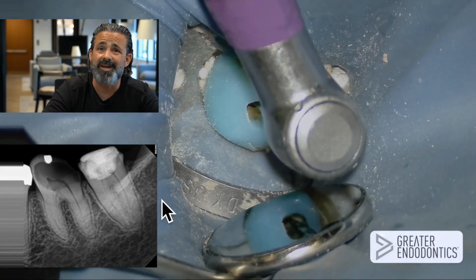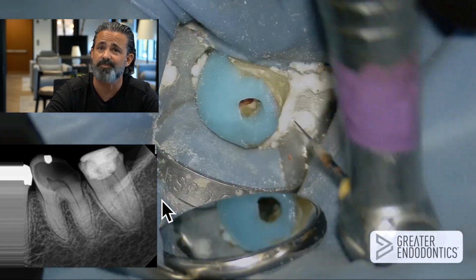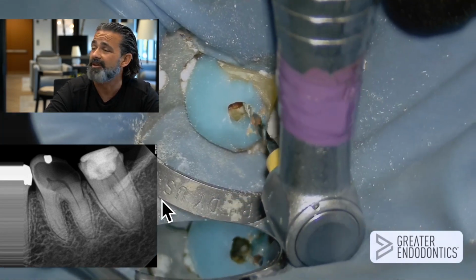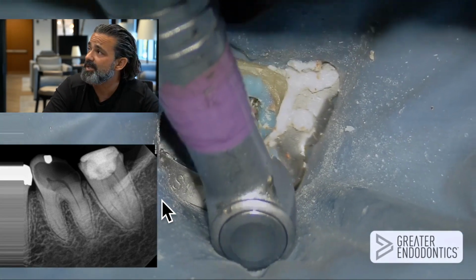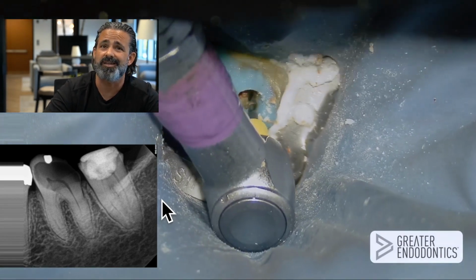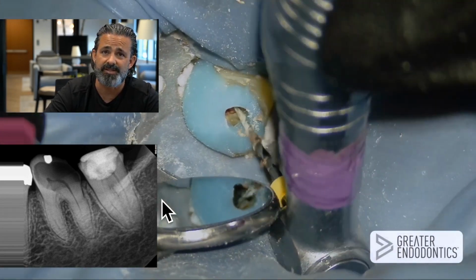And then I'm going right to an SX. And I've talked about this before. I consider the SX a rotary explorer. I'm picking at it with it. I don't really care how far it goes. I go to where it just lets me. I'm not going to put a lot of heavy-handed force on that. It's just light. I just go where it goes. I'm not really considering this an enlargement instrumentation as much as just so I can pass another file in there passively. My next go-to file, by the way, is a 1506.